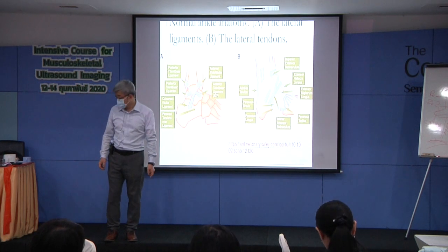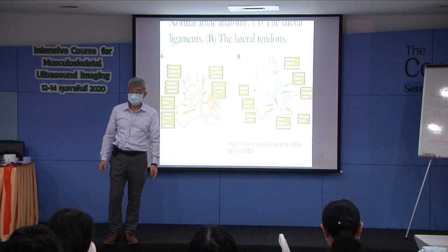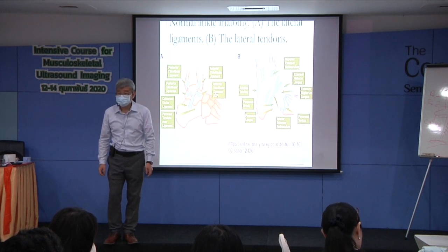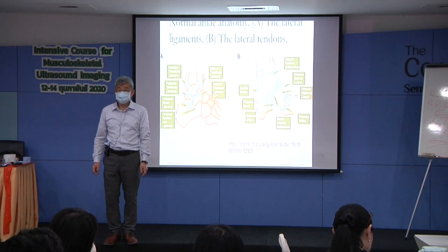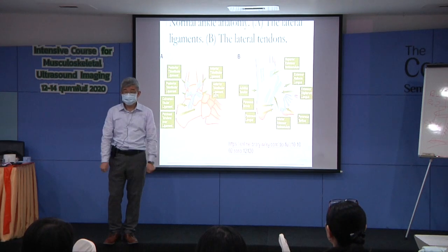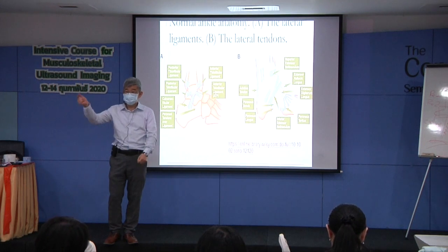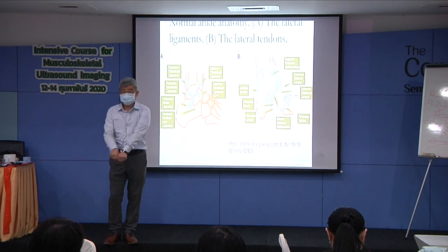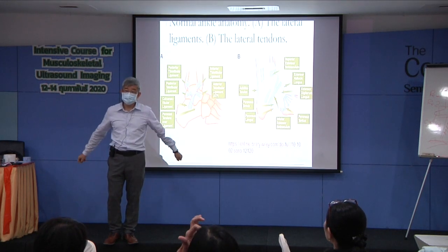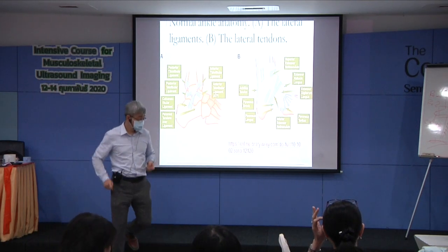But now I'm going to show the skill for the lateral leg and the posterior leg. Then we have our lunch, and we have practice. Okay? Any questions? Okay. One more, plantaris. Yeah, Achilles, because we are going to look at the Achilles. Why not look at the plantaris as well? Okay, so let's do it.